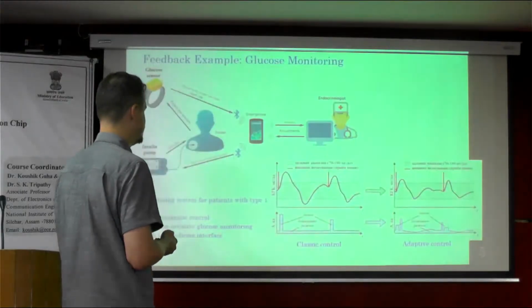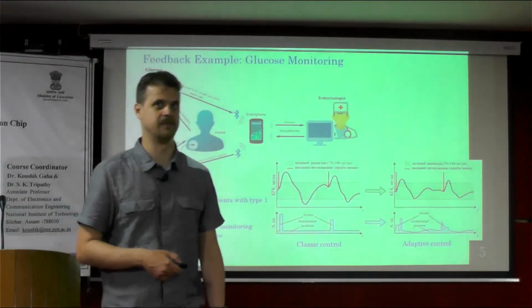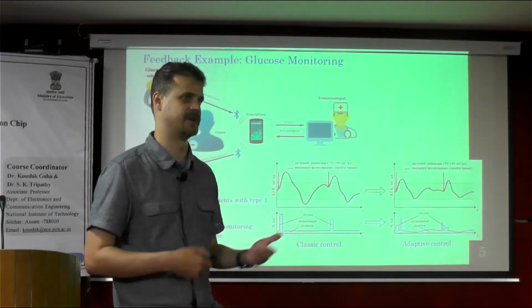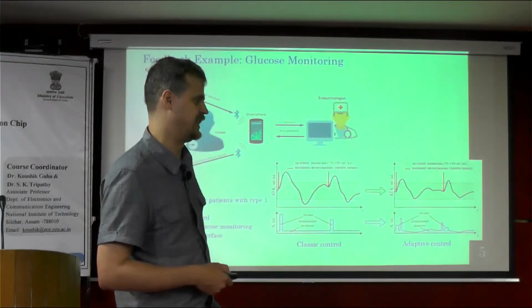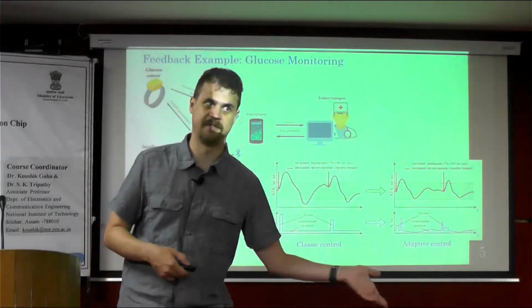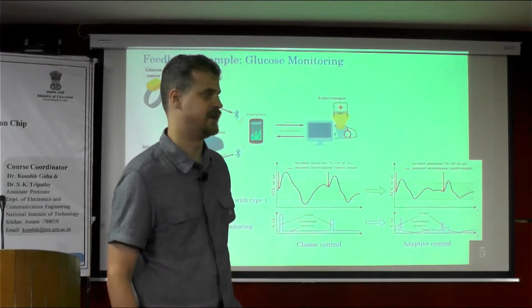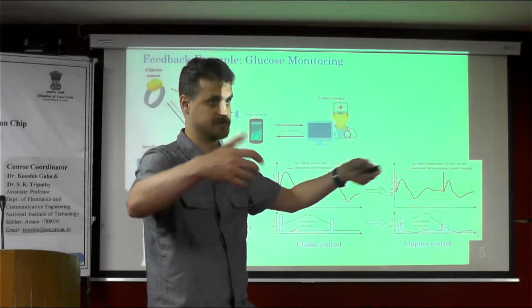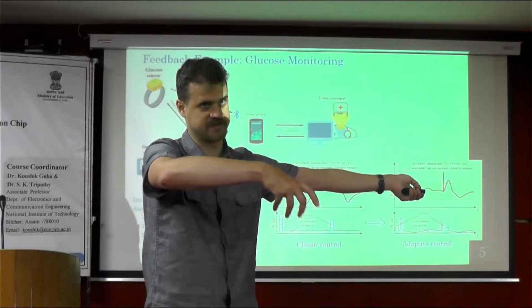Just to explain this idea, if we talk about the implantable artificial kidney, at some point we have to control the glucose concentration as well. If we talk about the conventional methods of glucose concentration control, they usually require an enzyme to decompose the glucose into components that change the optical properties of the solution.